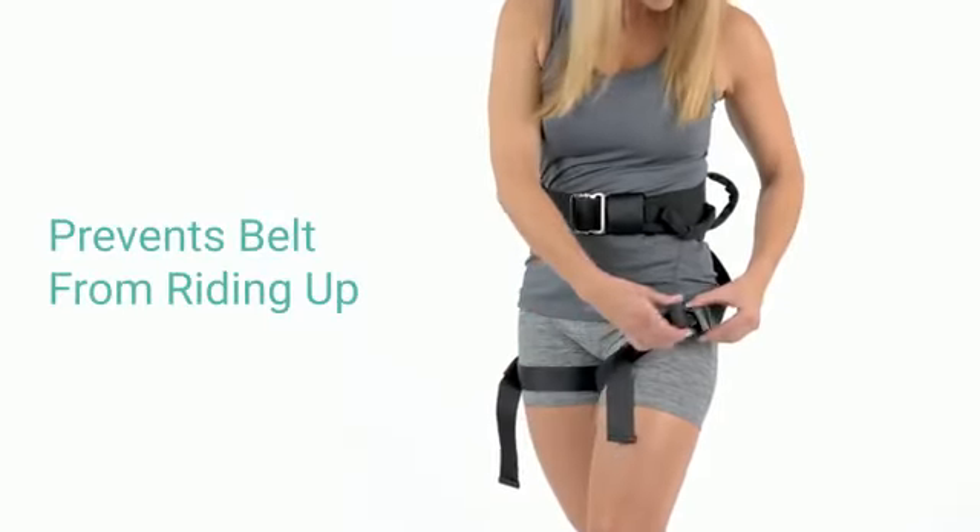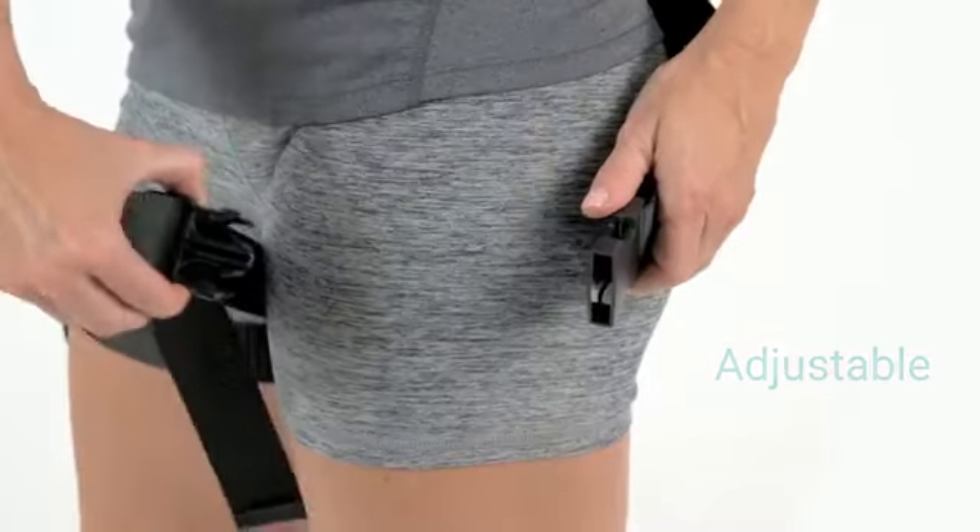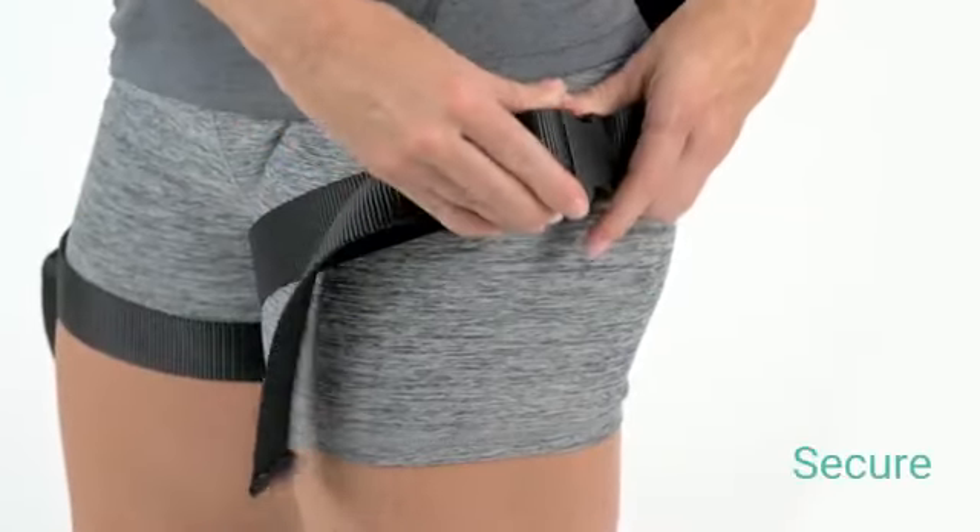Two integrated leg straps anchor the belt to your legs, preventing it from riding up and evenly distributing weight. Adjustable buckles secure the straps to ensure a perfect fit.